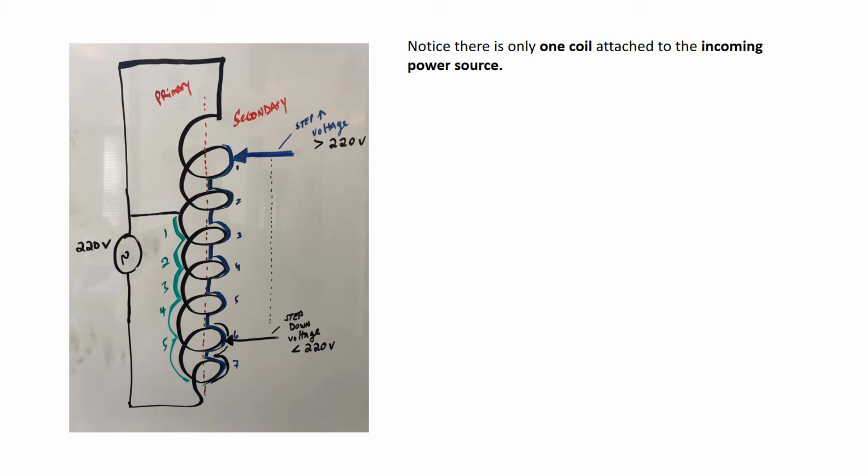This arrow, this point of contact, has the ability to move up or to move down. So I have one thicker arrow drawn in position number 1, and then another arrow, a little thinner arrow, drawn at position which would be 6 here. Now that arrow, that point of contact, moves up and down when you change your kilovoltage.